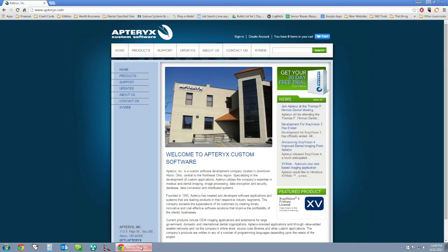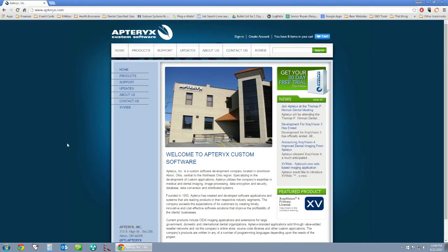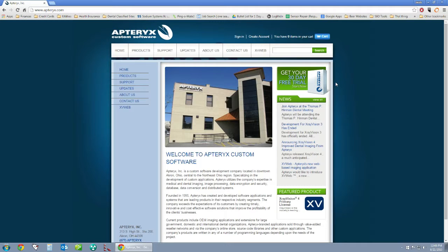From the Apteryx website, just open up a web browser and go to www.apteryx.com — you can see it right up here in the address bar. On the main page, in the top right corner, there is a link to get your 30-day free trial. If you click on this link, it will download the install file to your computer.